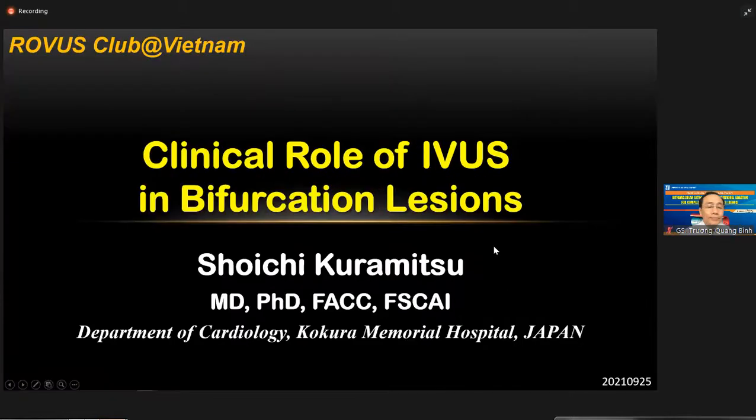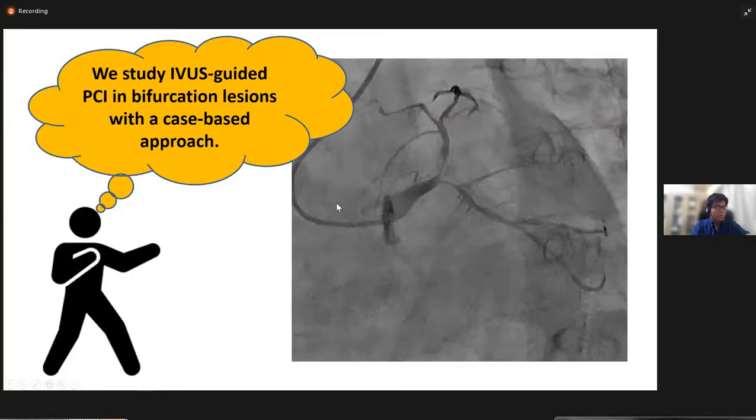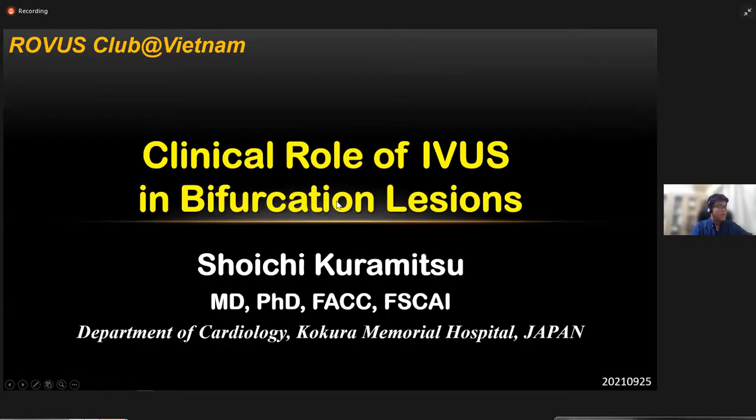Okay, good. So first of all, I thank all of you for giving me the great opportunity to talk about IVUS guided PCI in bifurcation lesion. Today my title is clinical role of IVUS in bifurcation lesion.